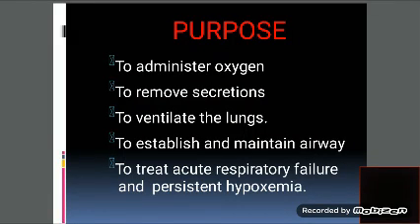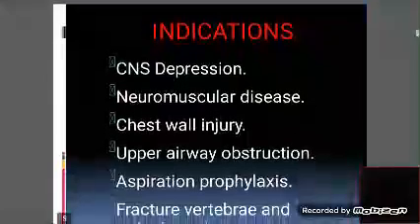The purpose is to open up the airway of the patient so that we can administer oxygen, medicine or anesthesia; to remove any secretions or blockage, which helps to open up the airway of the patient; to ventilate the lungs of the patient; to establish and maintain the airway of the patient; and to treat acute respiratory failure and persistent hypoxemia.